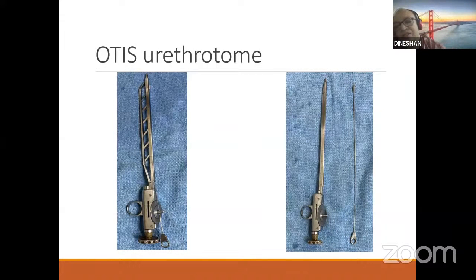You have to cut the urethra, or in other situations, especially in patients with meatal stenosis in postmenopausal ladies, if you want to do a meatotomy and a urethrotomy. These are the two common indications for using the urethrotome.